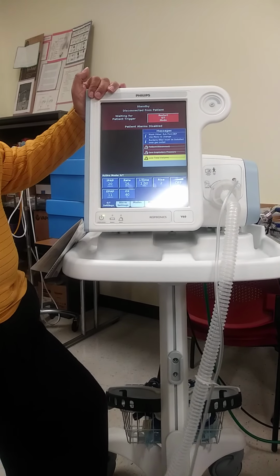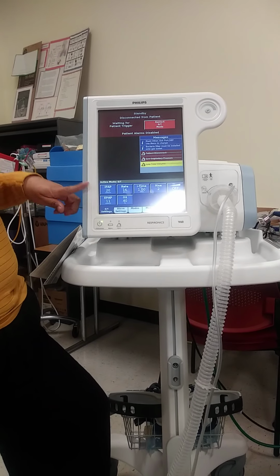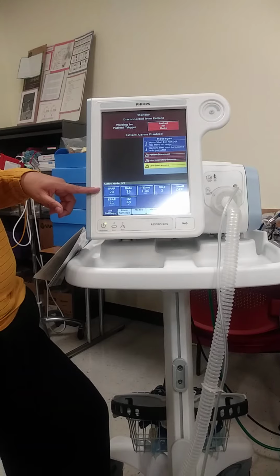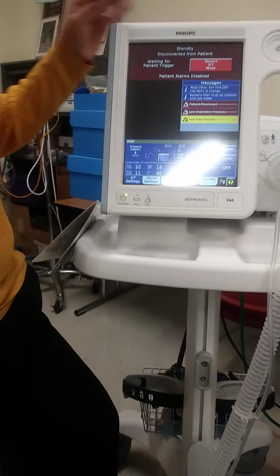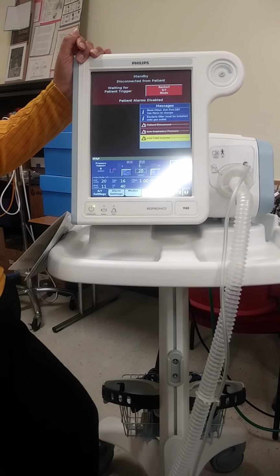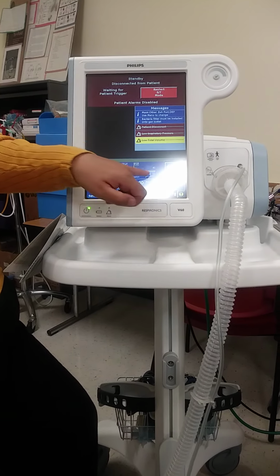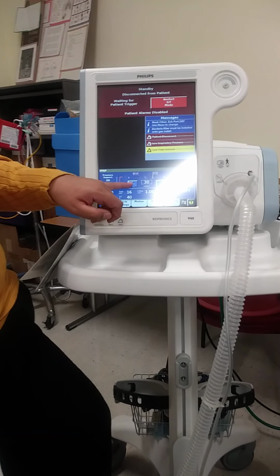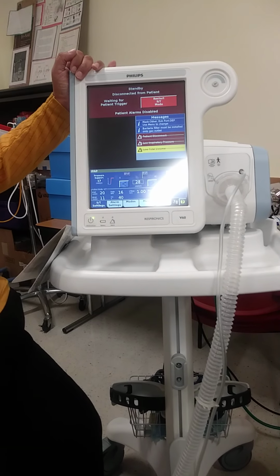With your BiPAP, these are all your settings. I have a pressure on the inspiratory phase. The lowest it can go, it tells you right there, is 4, and it can go as high as 40.